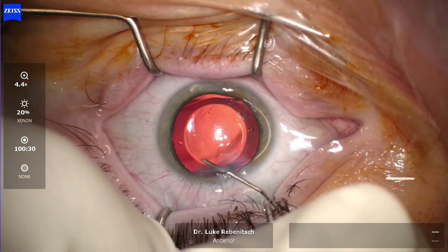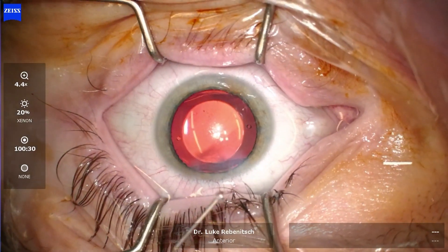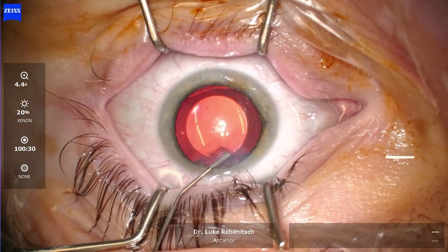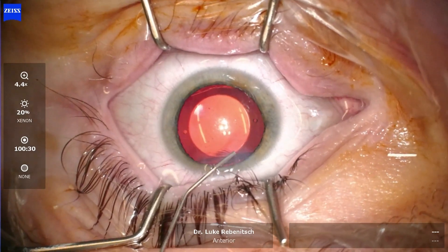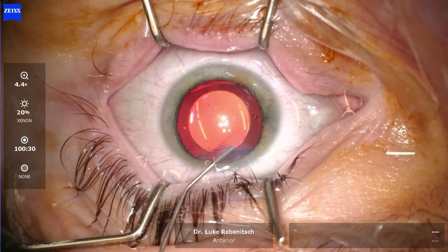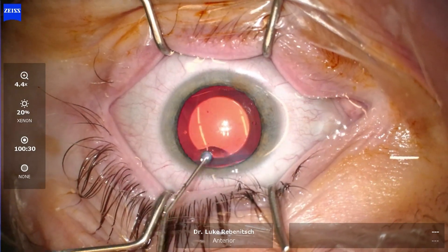Right now we are removing the jelly-like substance with saline solution. Typically we use two to three syringes to do so. This patient is already seeing better, but as you can imagine, as the pupil comes down and the dilation goes away, the quality of vision is going to improve. The last thing we do is place an antibiotic inside the eye to diminish the risk of infection even further.